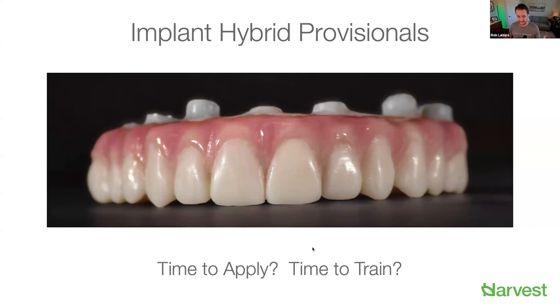Her application time on a case like this is about 25 minutes. But it's also about time to train. Training new technicians using advanced composite can take months — someone jokingly told me it could take years. With Easy Gum, we believe training could happen in days and weeks. That's really one of the hidden gems: it's not only easy to use, but it's easy to train.